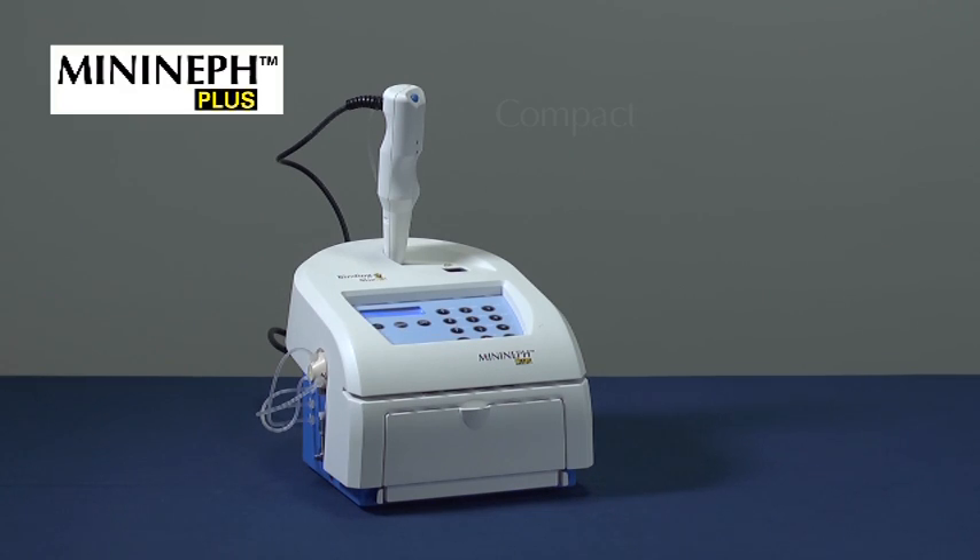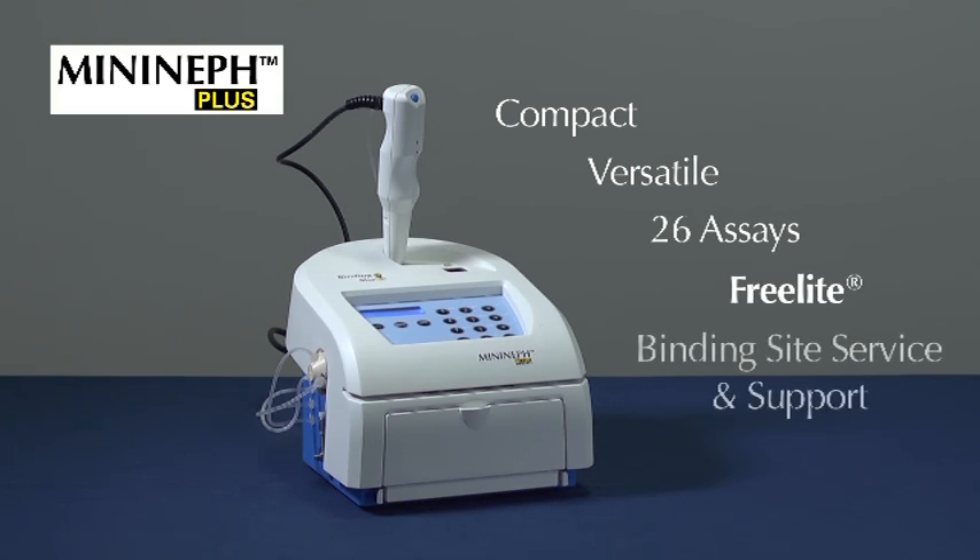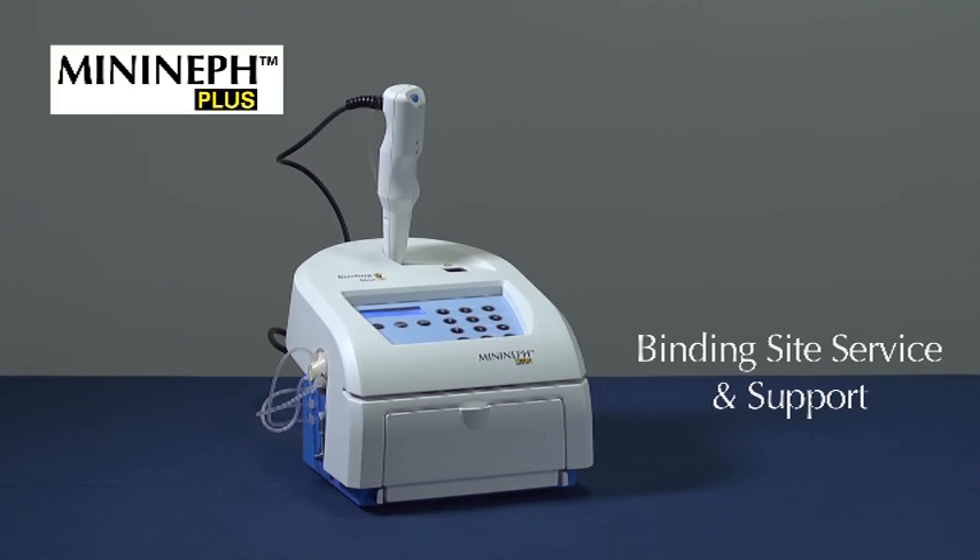The MiniNef Plus is a compact and versatile semi-automated nephilometer, which has been developed in combination with 26 routine and specialist protein assays, including FreeLite, to provide optimal precision and accuracy.